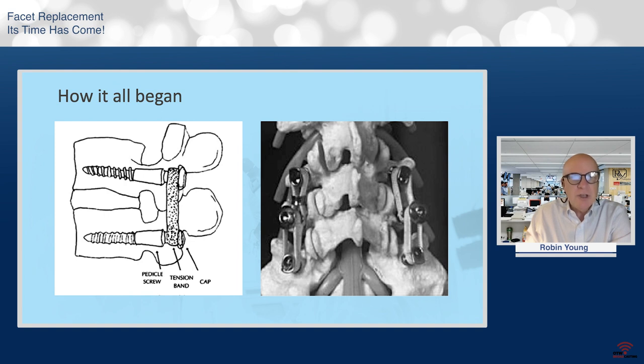So where do we begin? I suggest, as a way to contextualize tonight's masterclass subject, we start with the earliest pedicle screw-based posterior motion preservation device, which was the Graf ligament, invented by Dr. Henri Graf. This French surgeon came up with the idea of looping a pair of braided polyester cables around pedicle screws in order to constrain motion across the unstable spinal segment. His hypothesis, which found expression in his implant, proved to be effective in constraining flexion extension and opened a new way of thinking about spinal stabilization and, of course, prompted a new generation of posterior non-fusion devices.